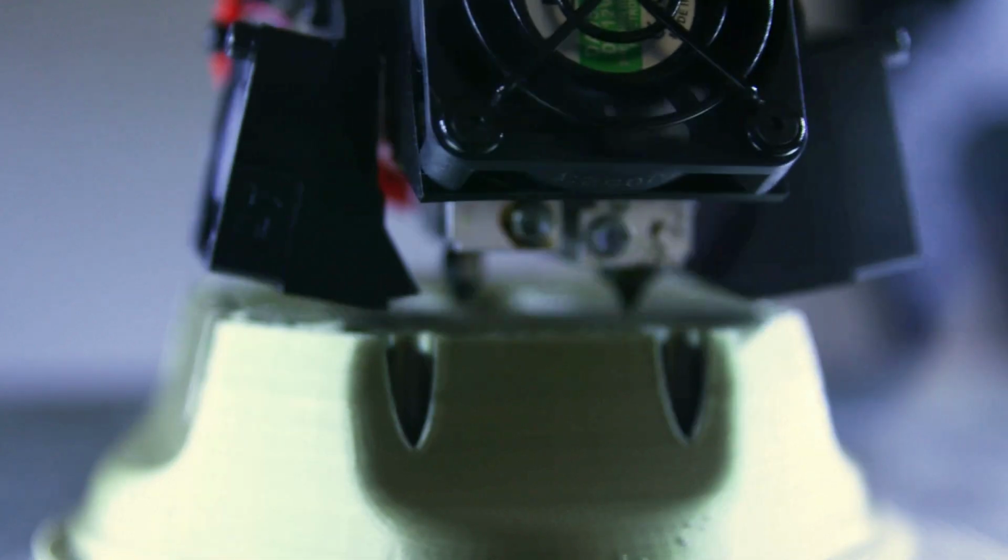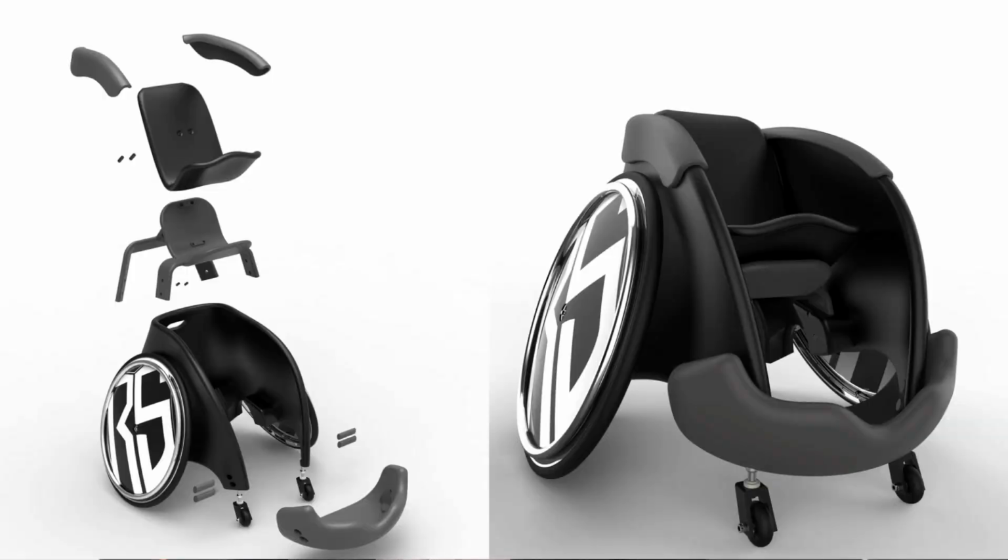The advantage of this is that we don't need to rely on supply chains. If we need replacement parts, they can be produced locally on site and the chairs can be repaired. The idea of this chair was that it be made of plastic and that we could use recycled plastic waste to build the wheelchairs in the first place.